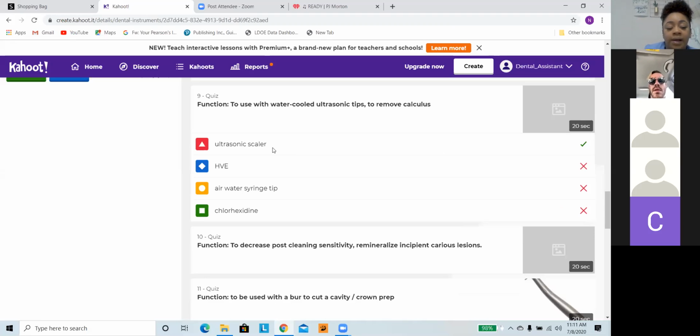Okay. I do have some tray lectures coming up, so we will go over each one. We left off on the crown and bridge, so we will be going into oral surgery. But has anyone had a cleaning with the ultrasonic tip? It'll look somewhat like a pin, and they will go along your gum lines, and it'll squirt water out. Yeah, that's what you would call your ultrasonic scaler.